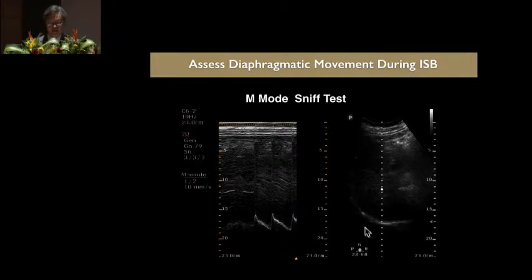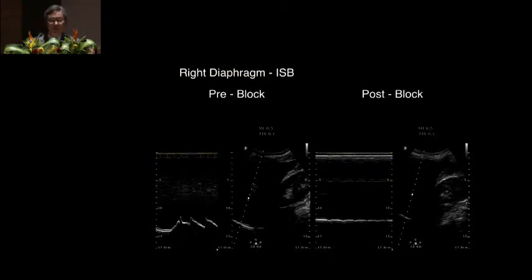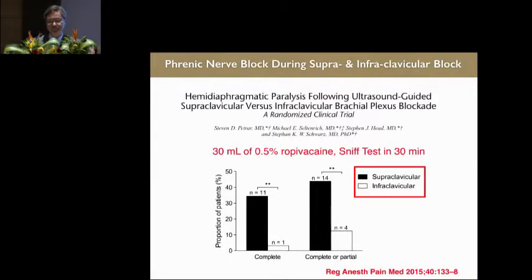So again, it's a very quantitative assessment. And this is after the block, very quickly. Within 5 minutes, the sniff test is flat, so you know the diaphragm is blocked. So I think with time, we can use ultrasound to also check for diaphragmatic paresis.